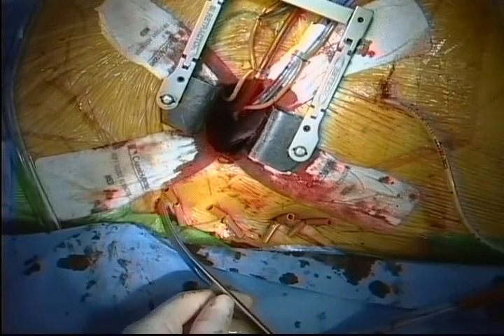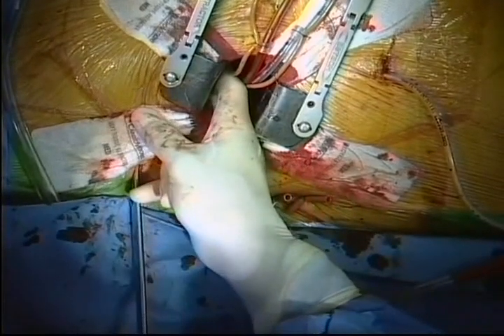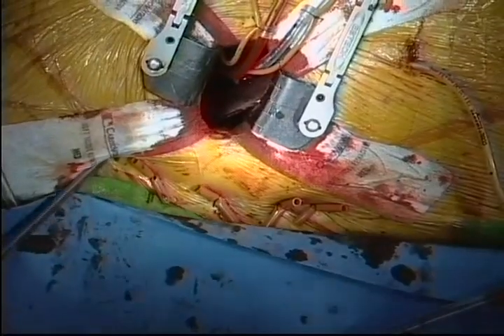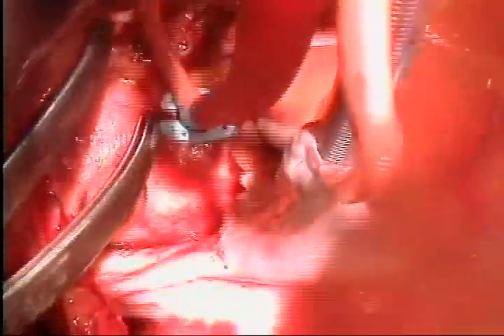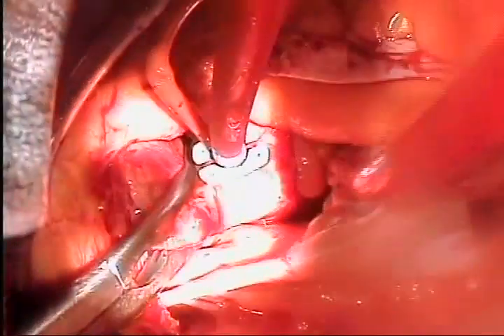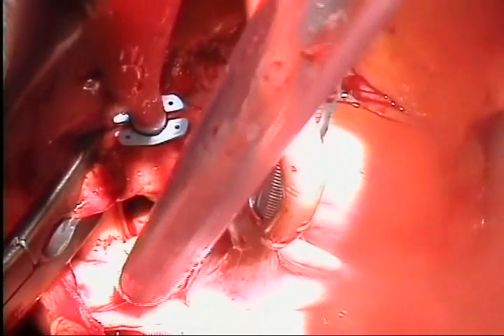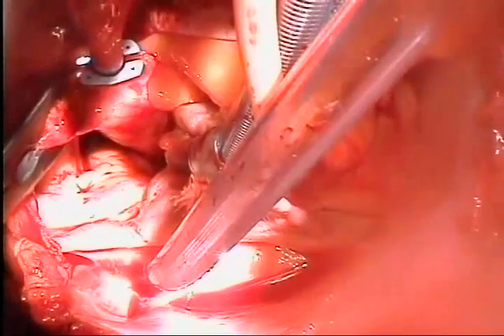The Chitwood clamp is then positioned through the same incision, again using a hand to guide its entry into the chest wall. Under conditions of low flow, the clamp is introduced just cephalad to the cardioplegic catheter. No dissection of the aorta is necessary in order to place the clamp. Accurate placement is confirmed by visualizing the tips. The cross-clamp crosses above the superior vena cava but does not obstruct the view of the pulmonary veins, as illustrated here.